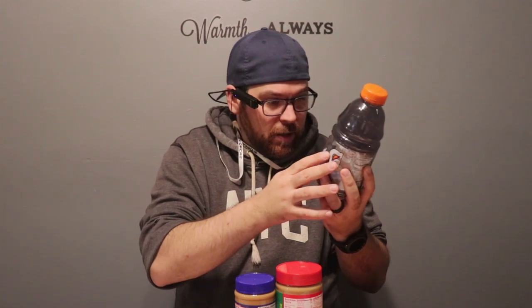So the way my vision is, if I'm in a grocery store, I see this bottle, I know it's a Gatorade because of the shape of the bottle, the orange cap on the bottle, and maybe, not really, but I mean, I know there's a G there, okay? Because I see a little bit of the G. Anyway, so I know it's a Gatorade, but I don't know what kind it is. And I have a hard time telling certain colors. So like in here, I don't see what color it is at all because the foggy gray in my vision doesn't even allow me to. So I'm assuming it's gray. But anyway, we're not going to delve into that. So if I wanted to know what it is, all I got to do is find the barcode on it.